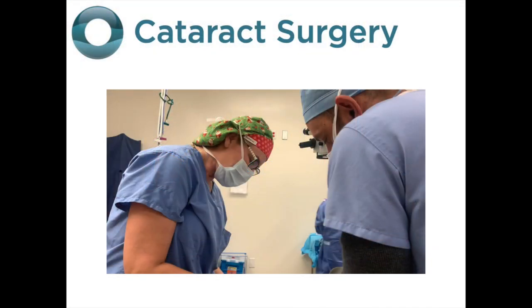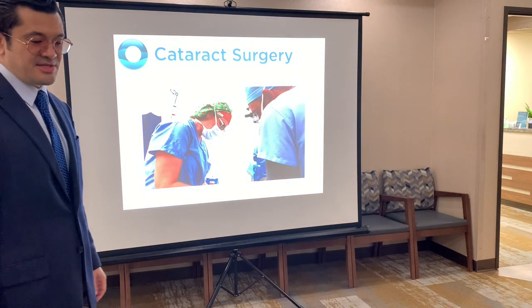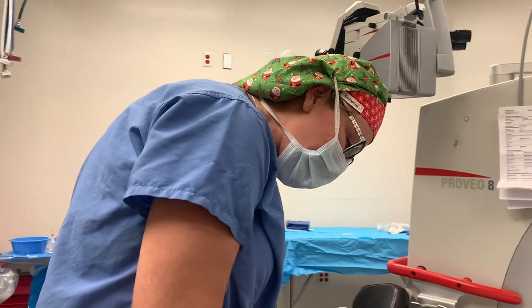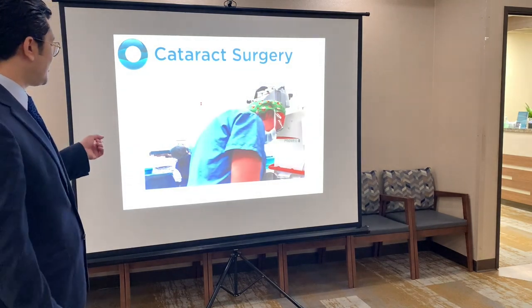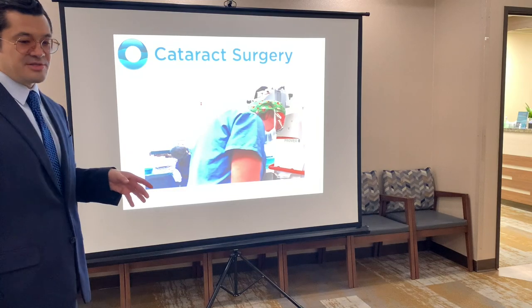That's Brittany. She's one of the nurses in the operating room. She gives those eye drops to the patient. So good, some of the video did show up in here. She put some of those eye drops there. You can see Laura doing those last minute preps, double checking everything as we're getting ready to start the surgery.